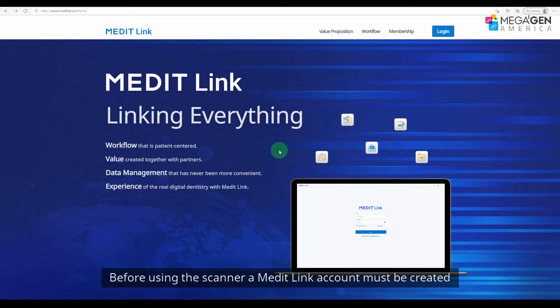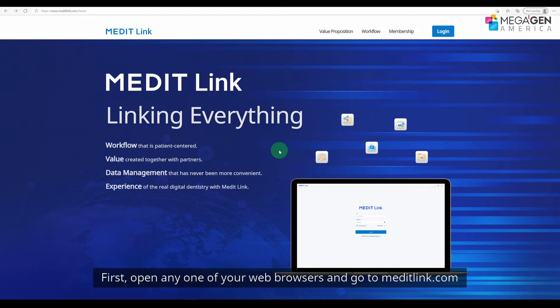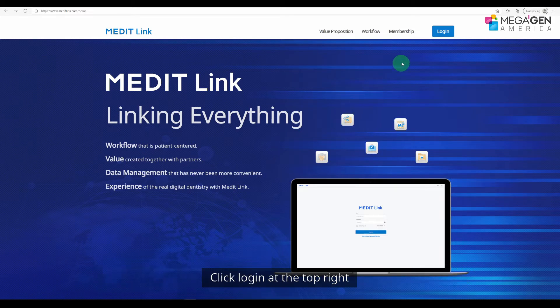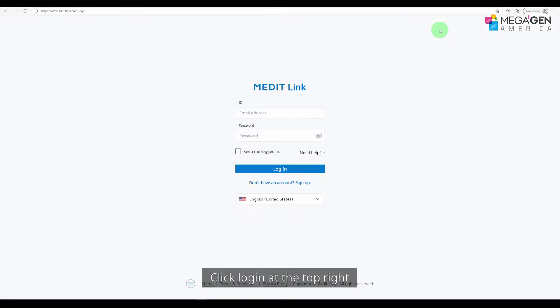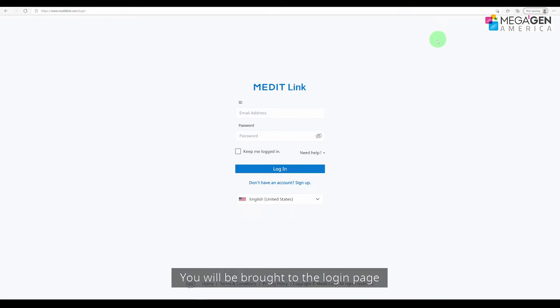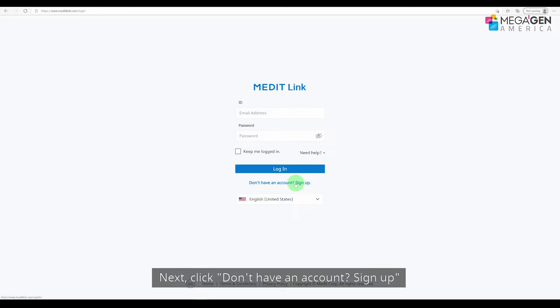Before using the scanner, a Medit Link account must be created first. Open any one of your web browsers and go to meditlink.com. Click login at the top right — you will be brought to the login page.